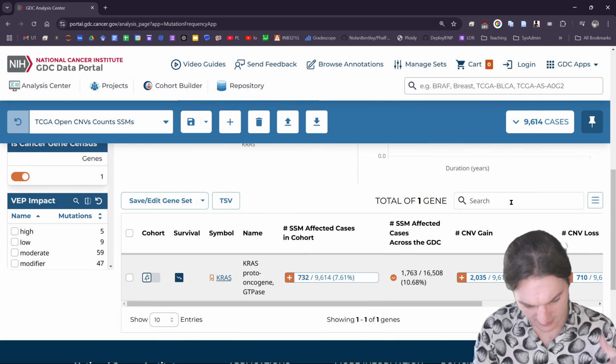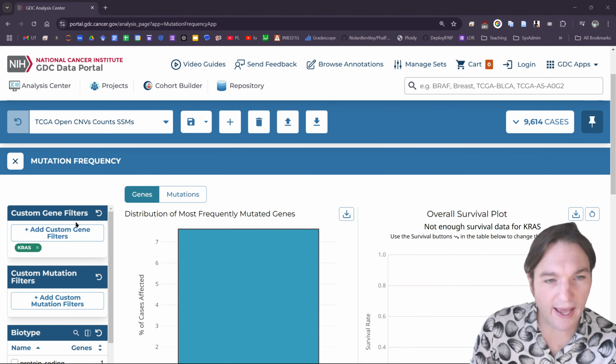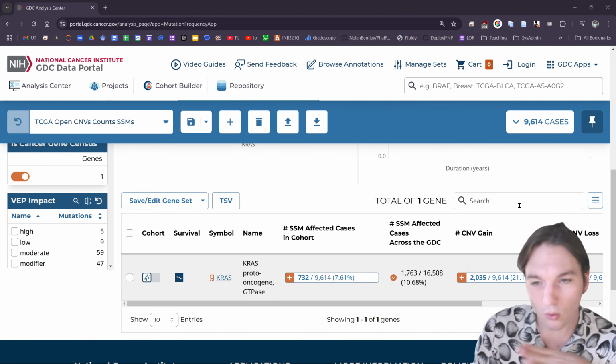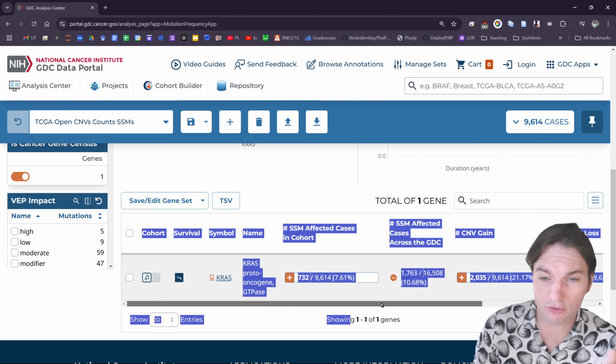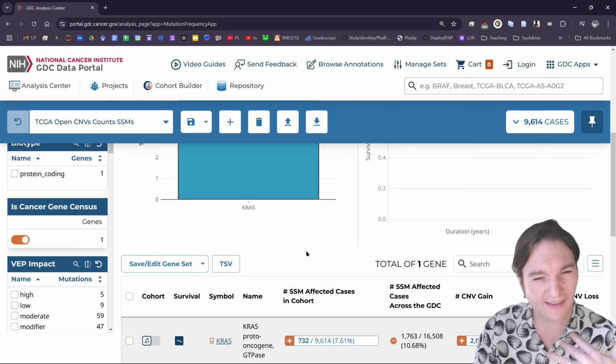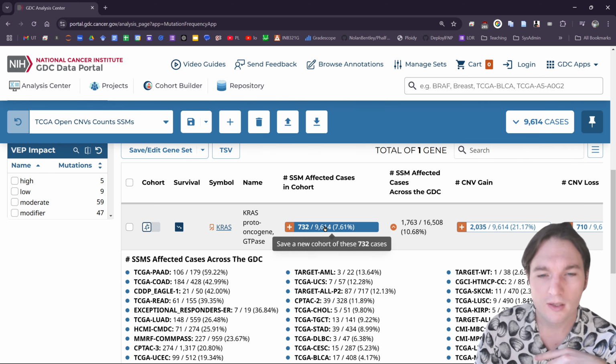And we're back. So when I filtered that at the top left, or here, I created a view that shows me the KRAS mutation. Now, the KRAS mutation actually was fairly high up in that list, and so I probably could have just scrolled down and found it. But sometimes if you're working with a different gene that's not at the top, it's helpful to be able to filter.